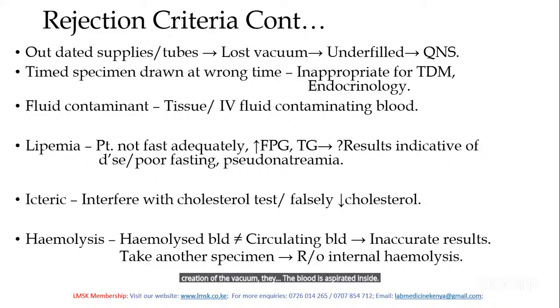So when they expire, the vacuum is also lost. If it is reduced or lost, that particular tube will be underfilled. It will not be filled to the required level because the vacuum is lost. So underfilled will result in quantity not sufficient, and maybe you are supposed to do multiple tests.